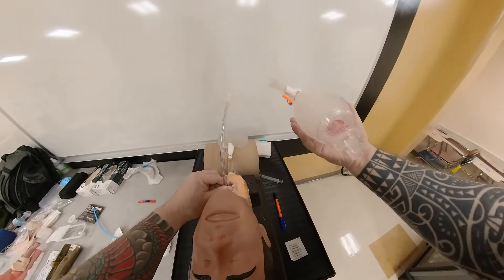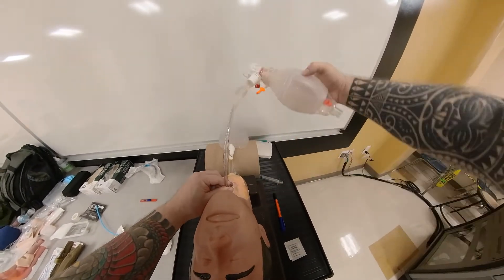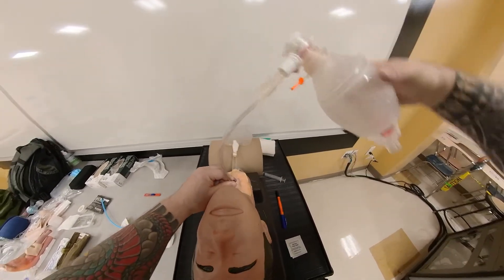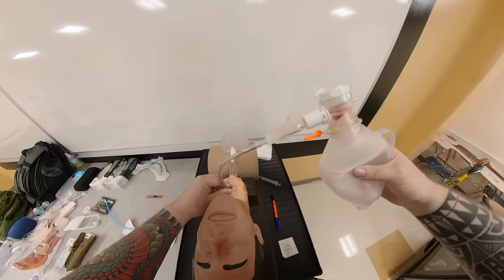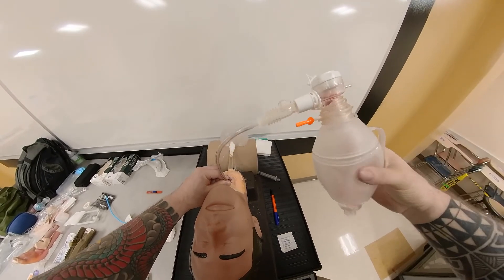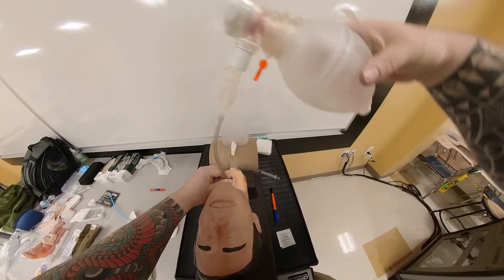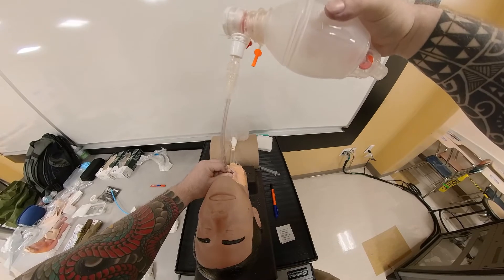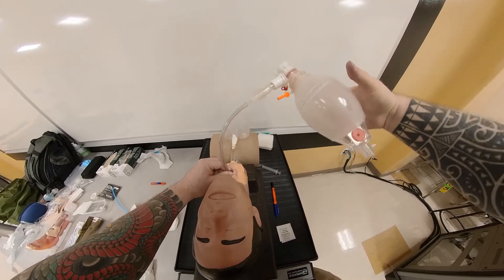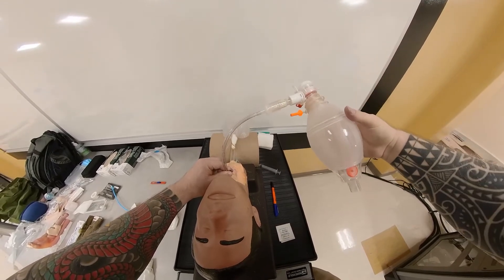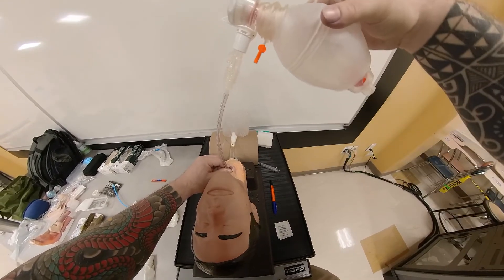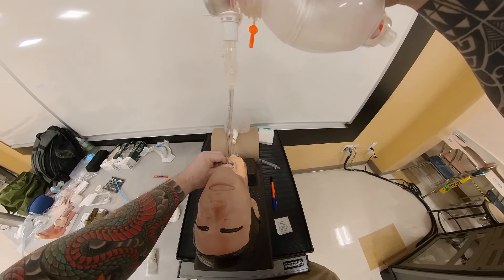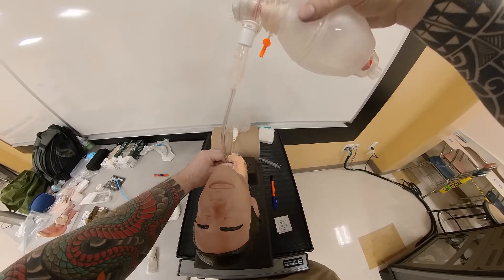BVM goes on, and the end-tidal CO2 detector is already connected. Check for chest rise. What's your value? 35–45 mmHg for end-tidal CO2. Once I'm comfortable that I have lung sounds, positive chest rise, and end-tidal CO2, I'm going to go ahead and secure this tube in place.